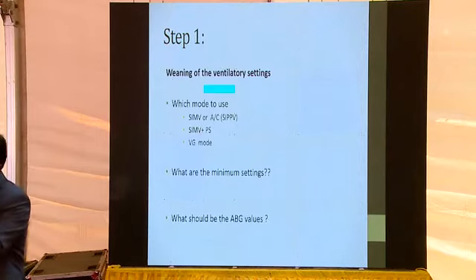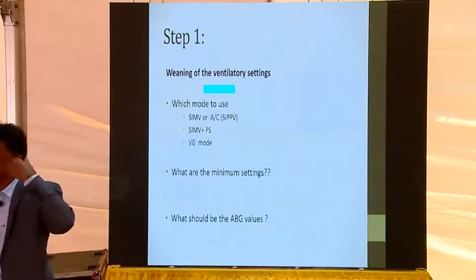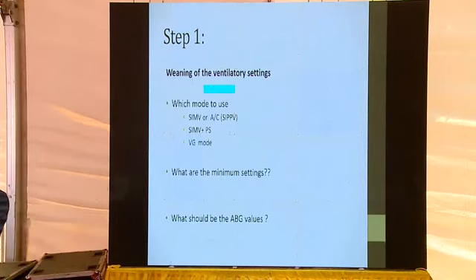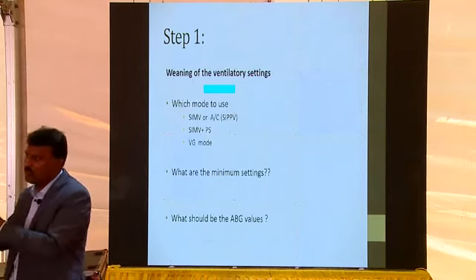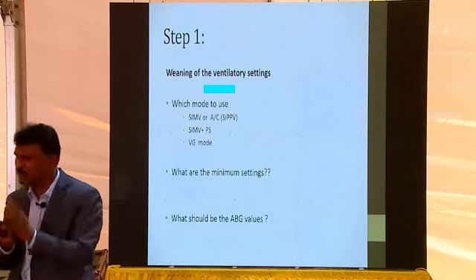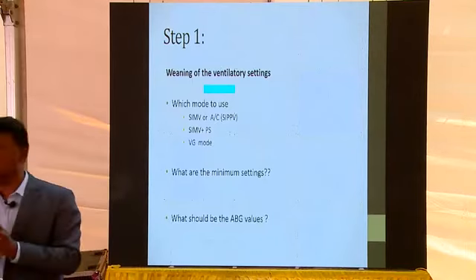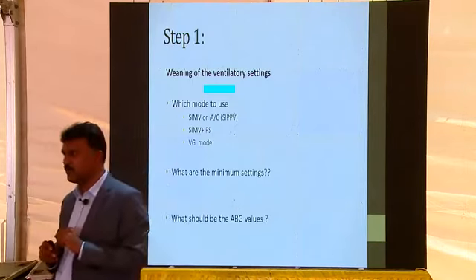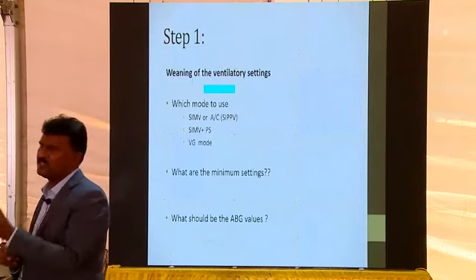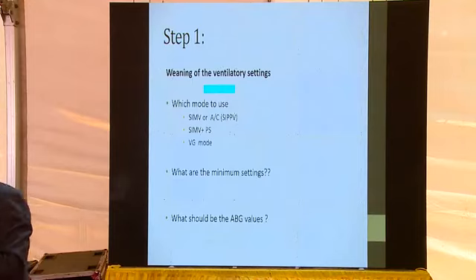We are not too sure what the end product of your tidal volume and minute ventilation is, but as I said rightly, whether we can only use pressure support.